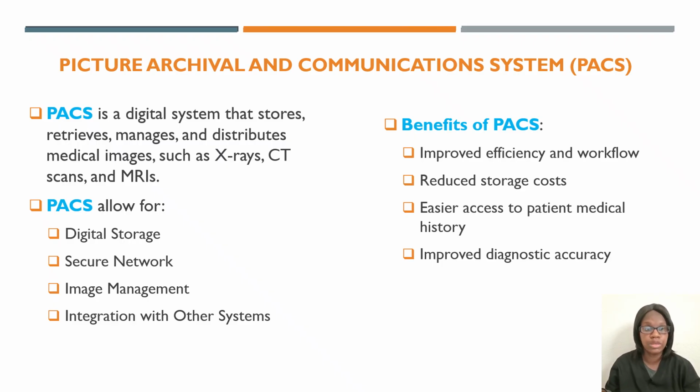PACS also allow for digital storage, secure network, image management, and integration with other systems. So the benefits of PACS are improved efficiency and workflow. It reduces storage costs. So with PACS, you do not have to worry about going in and deleting patient exams to free up some space like you do on the CT machine.